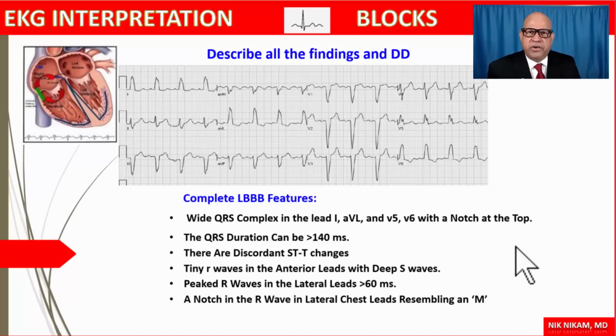Look for other conduction disturbances, such as first degree AV block or left anterior hemiblock, which will make this more significant. So instead of having a single left bundle branch block, you could be dealing with a bifascicular block or even a trifascicular block. You should always expect more than what is obvious on the electrocardiogram. Most of the time, the left bundle branch block is pathological. It is caused by significant underlying heart disease such as aortic stenosis, myocardial infarction, hypertension, or valvular heart disease, and sometimes brought on by cardiac surgery.